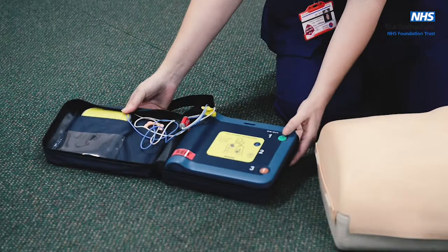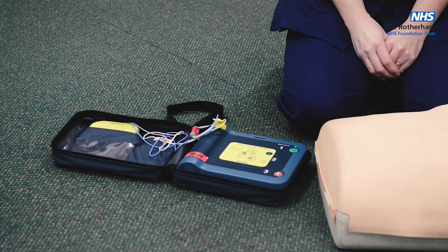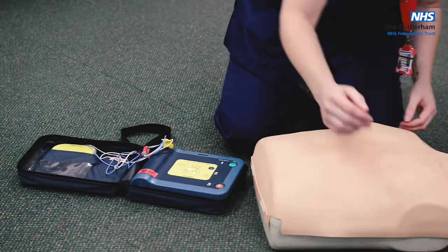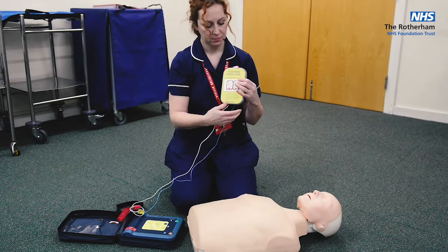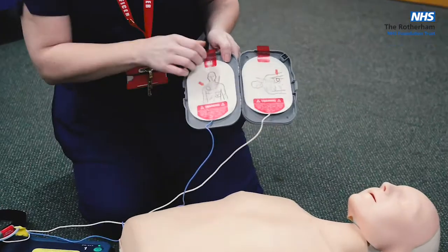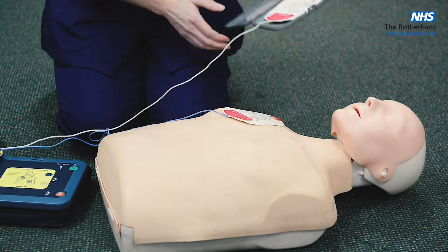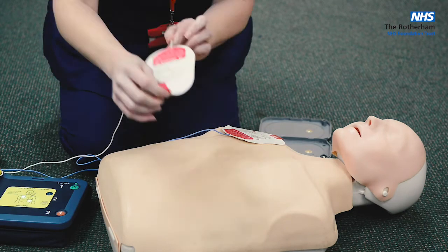Let's press the on button. Remove clothes from the patient's chest. All community AEDs should come with a pair of scissors to cut clothes off. Open the grey plastic case and peel off the white adhesive pads. Look carefully at the pictures on the pads, peel one pad from the grey case, and place it exactly as shown, pressing firmly to bare skin.